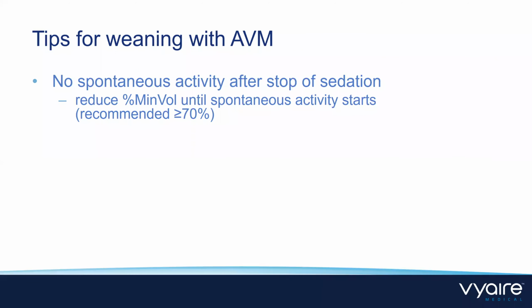And looking now at the ventilation and going to weaning, we stop the sedation for the patient, for example, and the patient is not breathing spontaneously. And that's the only reason where you might consider to decrease the settings to a lower value than the 100% where we're starting with. Usually in most ventilations, you're increasing over time. And at some point, the patient starts to breathe with 100% minute volume, and this is fine.